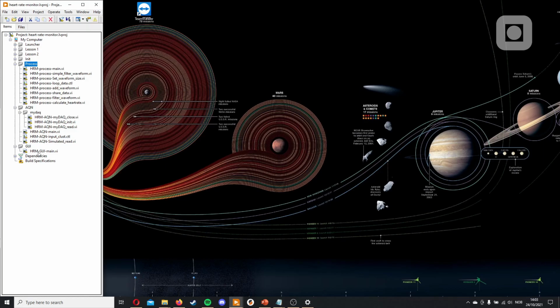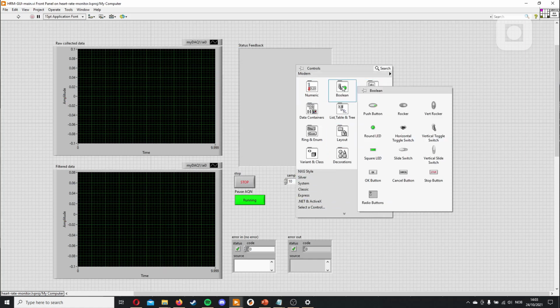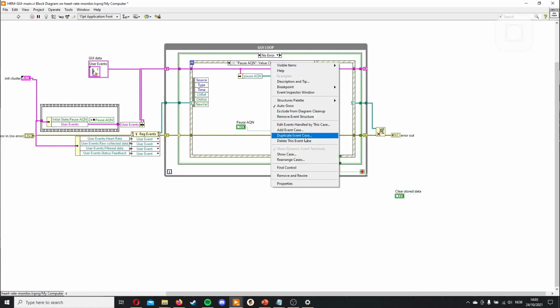The first thing we can do is just to add a clear button in the GUI. And we'll do that the same way as we always do it. Here, clear data, and we can call it clear stored data, just adding a little bit more information to the name. Let's put it here, and let's duplicate this one.